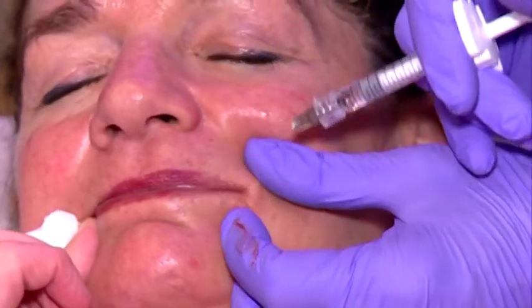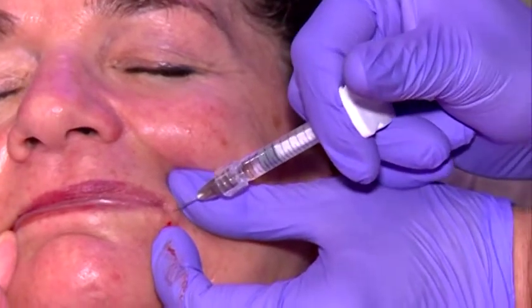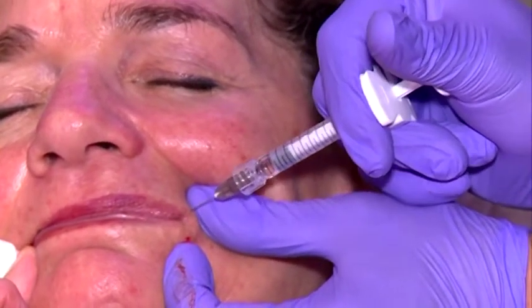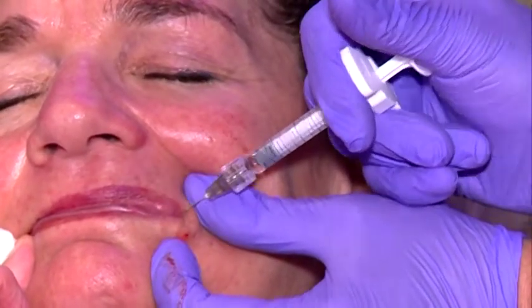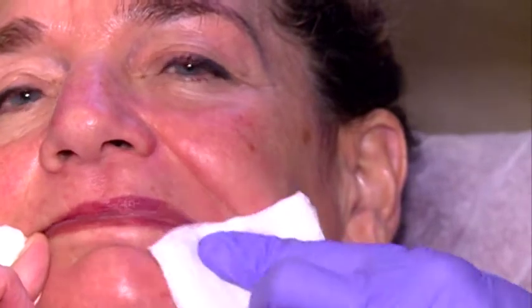And one more, the Mona Lisa smile, you can call it. Open the corner of the mouth. Do a little injection here. One injection here, and one injection into the upper lip. Sorry. Now you're done. Can I get a dry gauze? Yes, thank you. Just to elevate it a little bit.